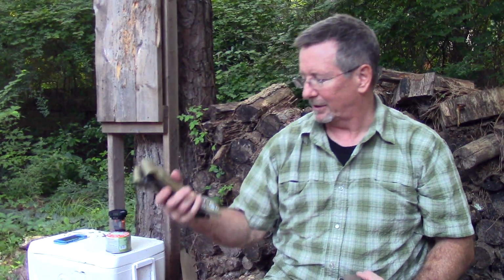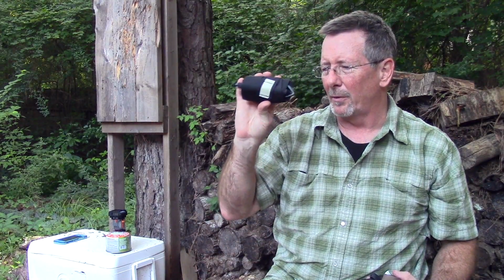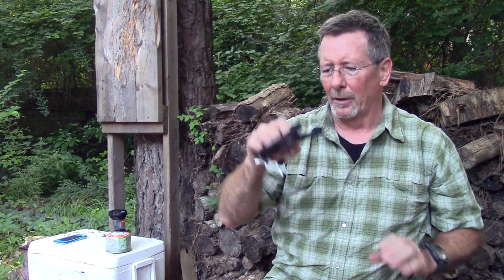So just to recap, three basic styles of tourniquets: the ratchet tourniquet, like the TX2, a good tourniquet but not my favorite EDC. The SOFTT or the CAT tourniquet, a windlass style tourniquet, again really good, but the negatives for me are that it won't go very small, and it's kind of bulky. Finally, my pick for EDC tourniquet is either the RATS tourniquet or the TK4. Of the two, I think I like the RATS better, just because it's a little easier to use.